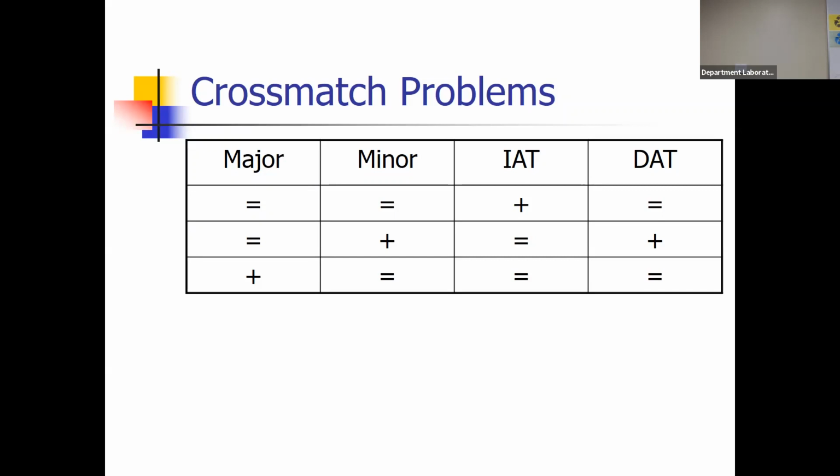If your IAT is positive and you identify the antibody and you give antigen negative units, then your major cross match should be negative, right? So this is described as antigen negative cross match compatible. Okay.